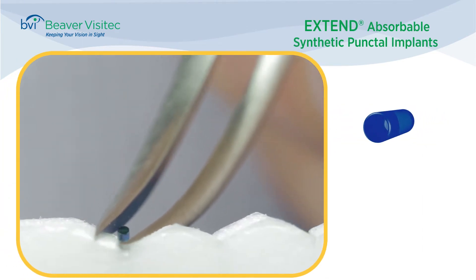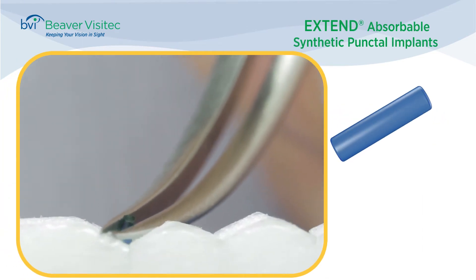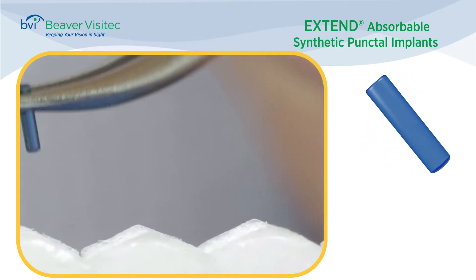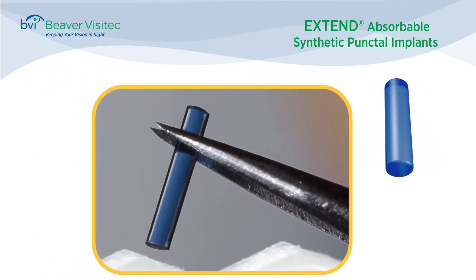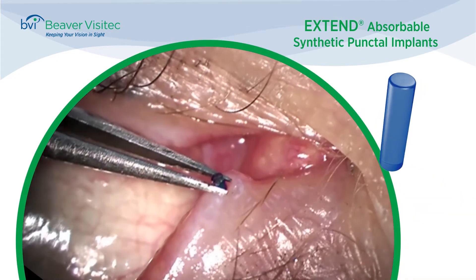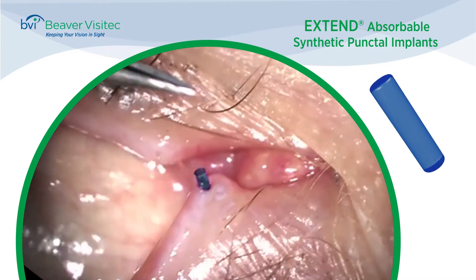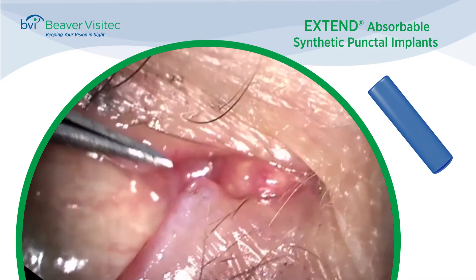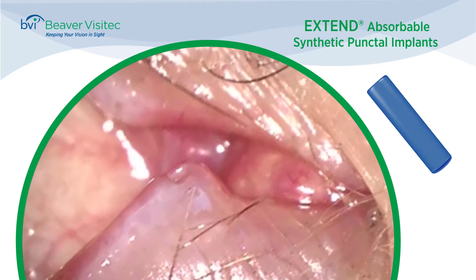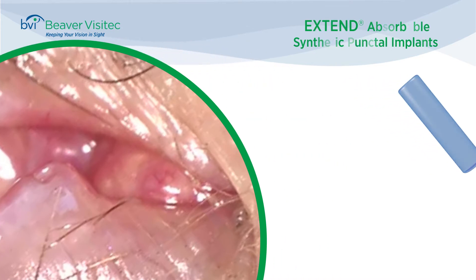Extend absorbable synthetic punctal implants are designed of a biodegradable material for mid- to long-term occlusion. To insert Extend, grasp the implant with forceps and insert partially through the punctal opening. Release and use the tip of the forceps to push the implant entirely below the lid margin and into the canaliculus. Following insertion, inspect to ensure the implant is below the punctal opening.